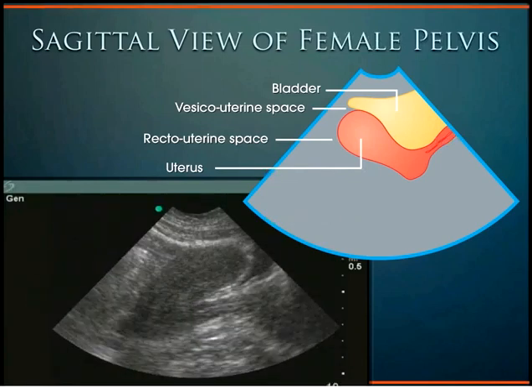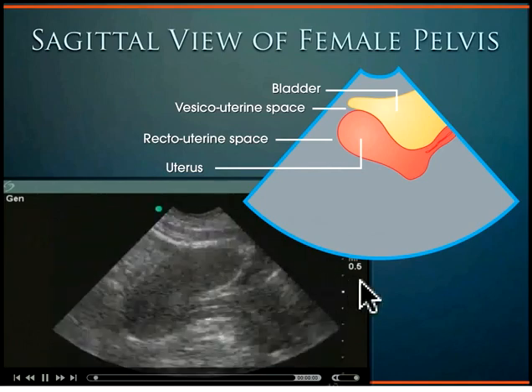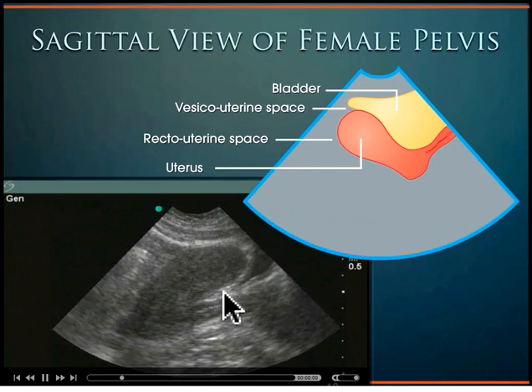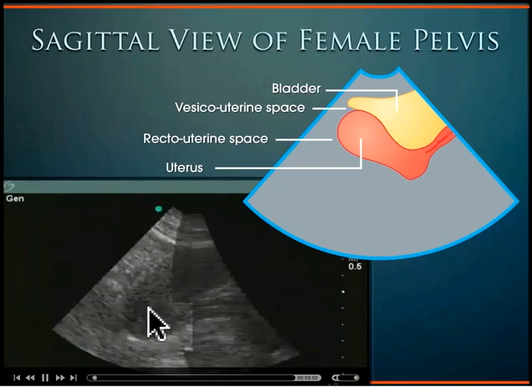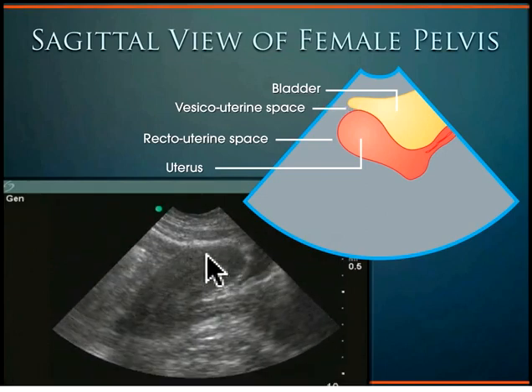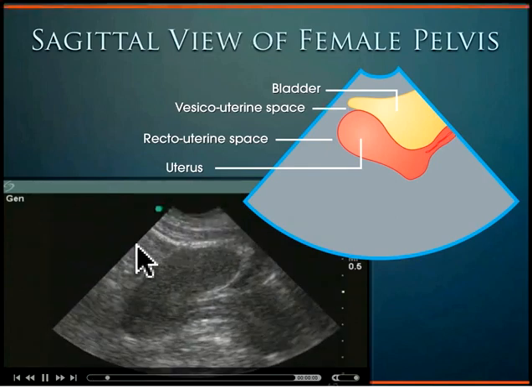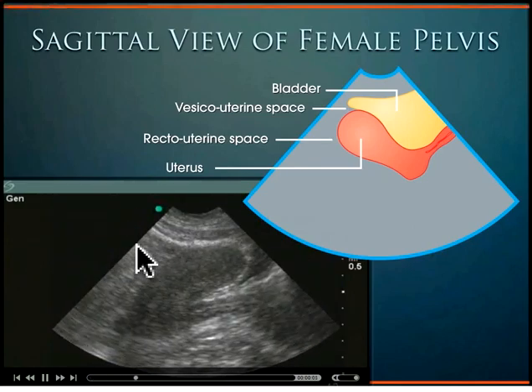And when the bladder is empty, we see now the bladder here is empty in this view of the female pelvis in the sagittal plane. We make out when the bladder is empty, this uterus becomes very anteverted. Here's that vaginal stripe, cervix, very anteverted uterus. As that bladder fills up, it will eventually push the fundus of the uterus in this direction, superiorly, making the uterus less anteverted with a much more prominent bladder.